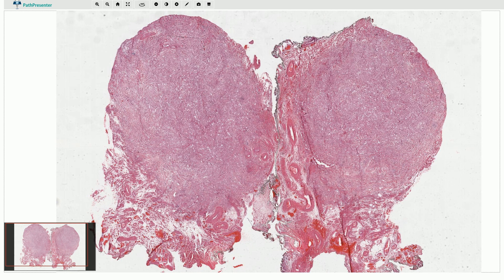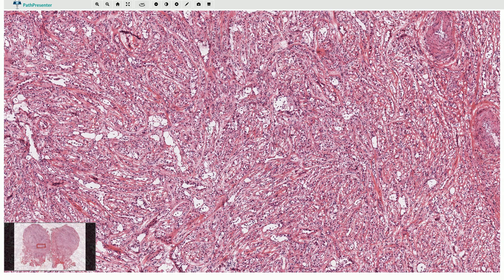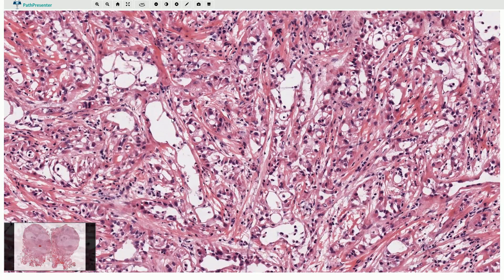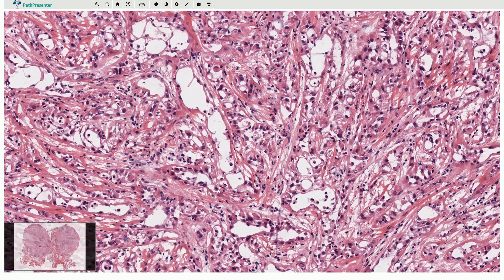The tumor is relatively well circumscribed but non-encapsulated. On higher magnification we can see that the tumor is composed of gland-like or tubular empty spaces. Some of them resemble vascular channels. Vascular-like empty spaces are lined by flattened mesothelial cells.